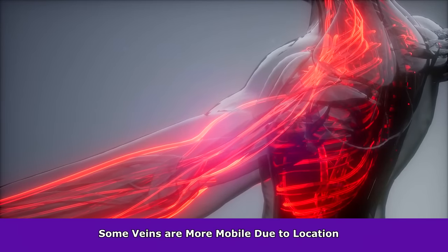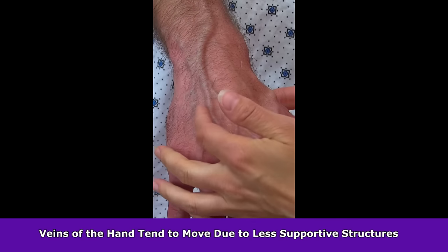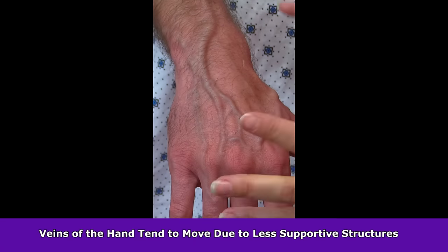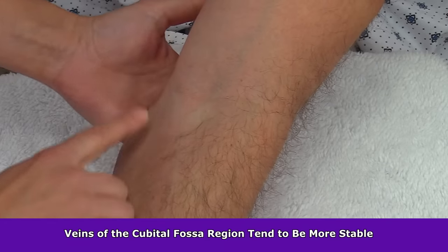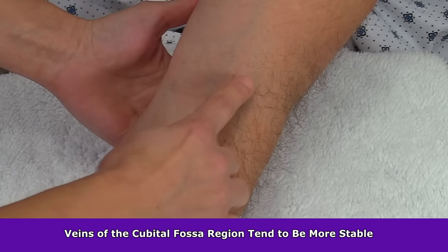Lastly, some veins move due to their location. For example, veins on the hand tend to be more superficial and have less fat and surrounding structures to help keep them in place, whereas veins in the cubital fossa region tend to be a bit more stable due to the surrounding muscle tissue.